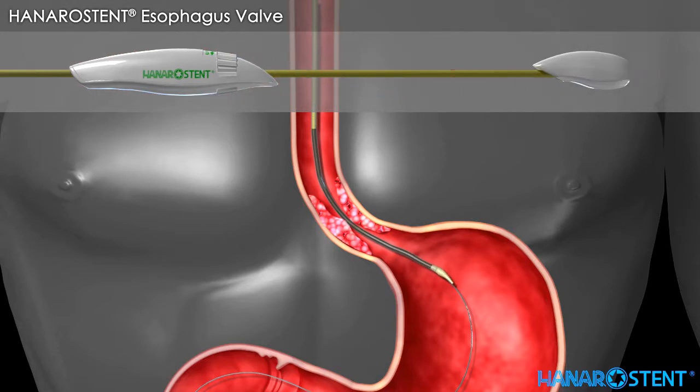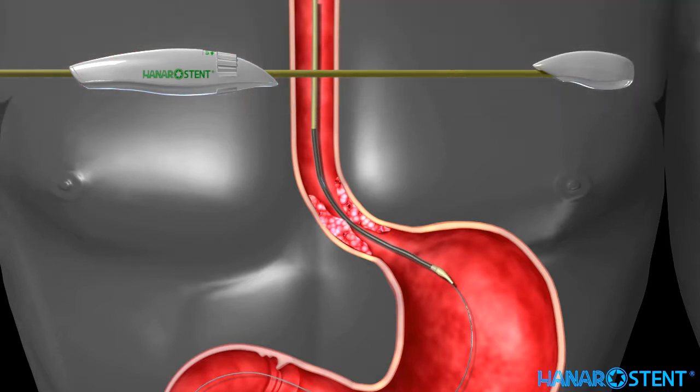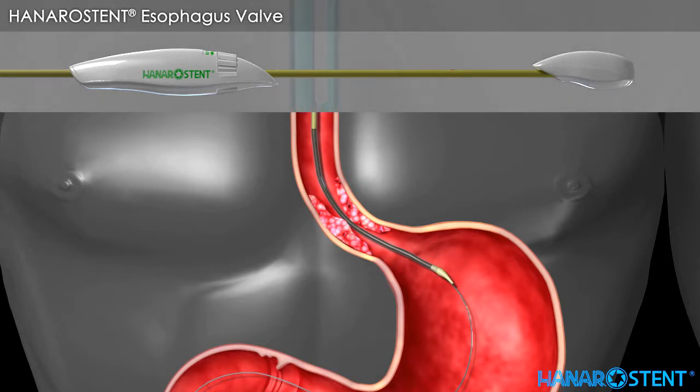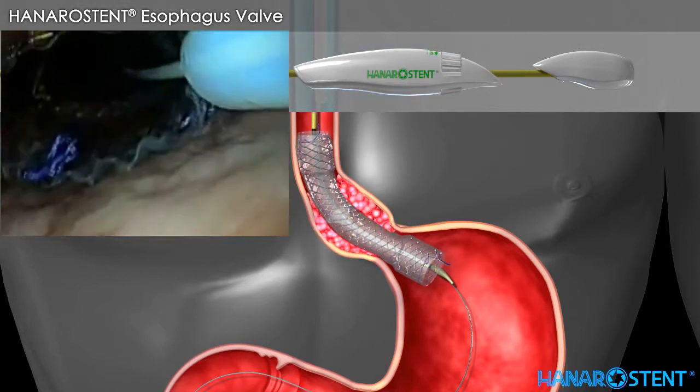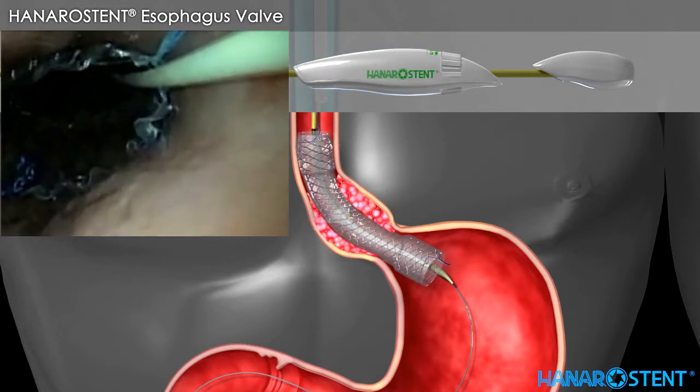Advance the delivery device along the guide wire and advance the endoscope. Check the location of the olive tip. Loosen the safety lock by turning it counter-clockwise after checking the location of the stent. Deploy the stent by pulling the outer sheath handle slowly while maintaining the location of the inner shaft handle. Check the endoscopic view of full deployment and drainage.